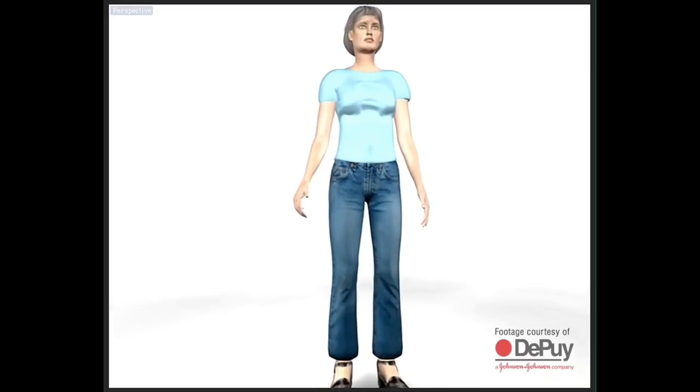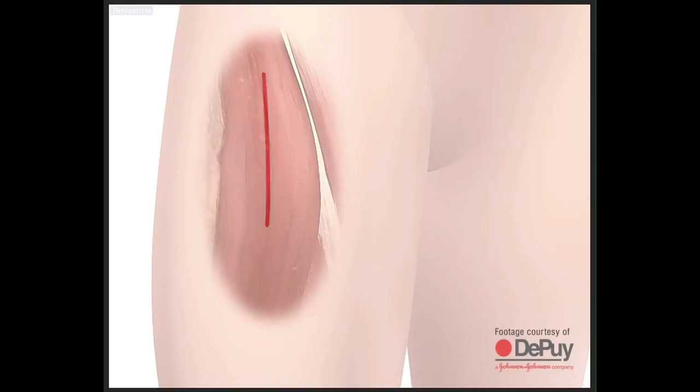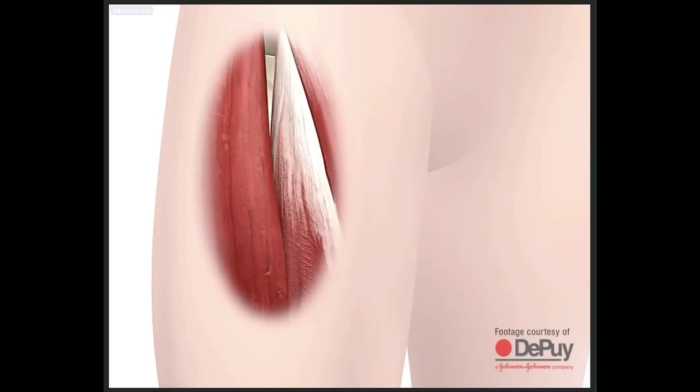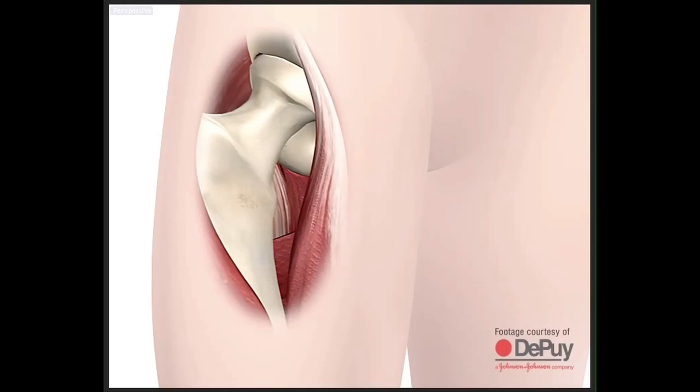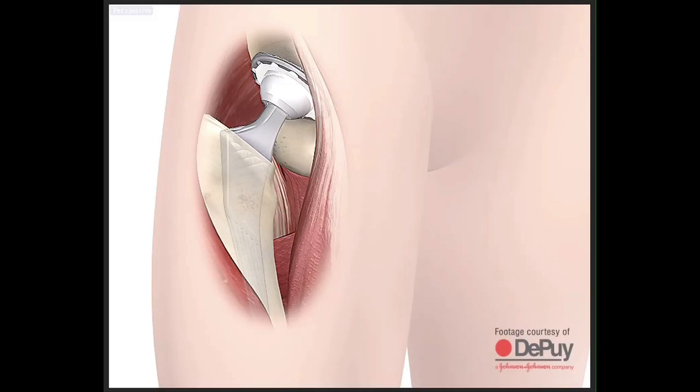What I like about the anterior approach is the incision is in the front of the hip. It's smaller. You don't have to sit on your incision, so it's a little more comfortable. But in particular, there's a direct interval between two muscles. You don't have to cut muscles to get to the hip. So you spread the muscles, you have direct access to the hip joint. You can easily get in the new hip prosthesis. This translates to a much faster recovery time, less pain in the first few days after surgery, and we can really get you back on your feet and back to doing things you want to do in general a lot quicker this way.